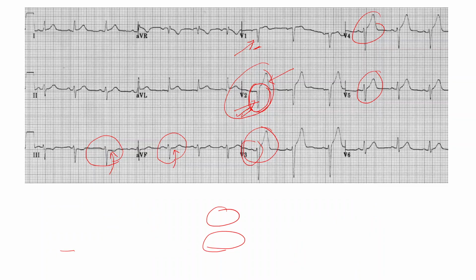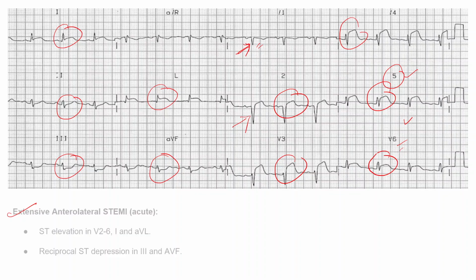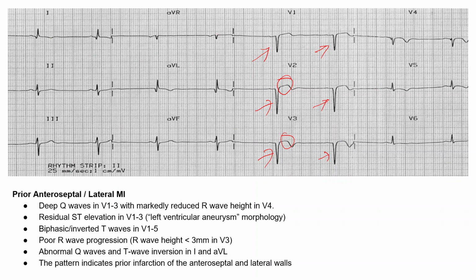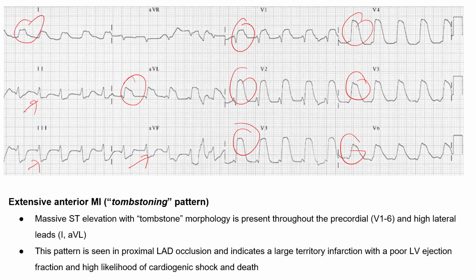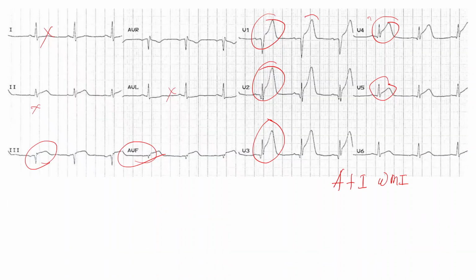And this artery usually doesn't supply the inferior wall. But whenever we find a case where we are getting ST elevation in anterior leads and along with that ST elevation in some of the inferior leads, that means it's an anterior plus inferior wall MI. So how will you explain this? It is explained by LAD. Of course, there can be involvement of two arteries, LAD and RCA or LAD and LCX, but it's a more likely situation if one artery is involved. If someone asks you how you will explain this anterior and inferior MI pattern with obstruction of one artery, this is known as LAD type 3, or the wrap around pattern.